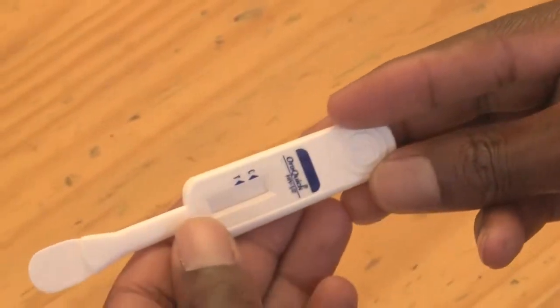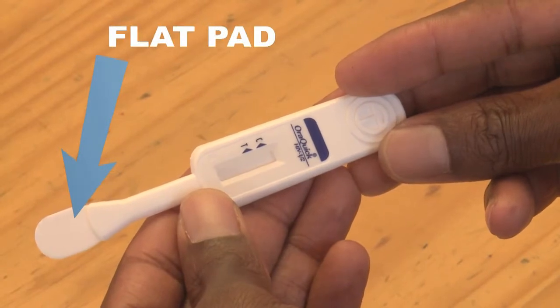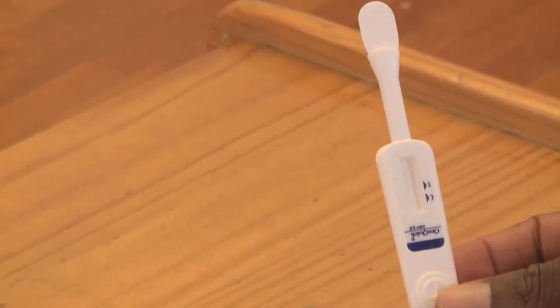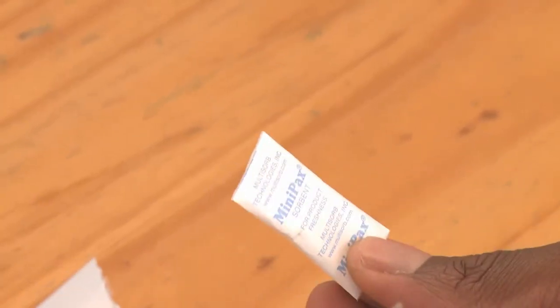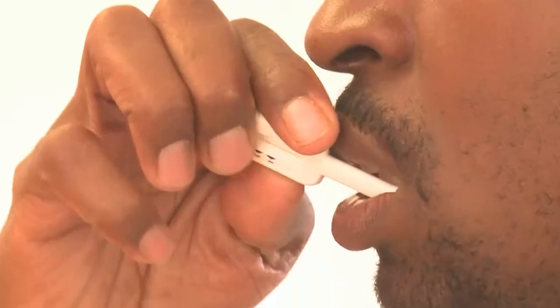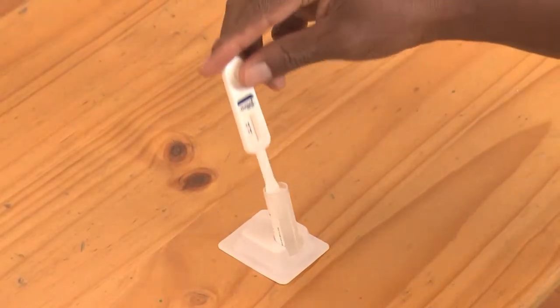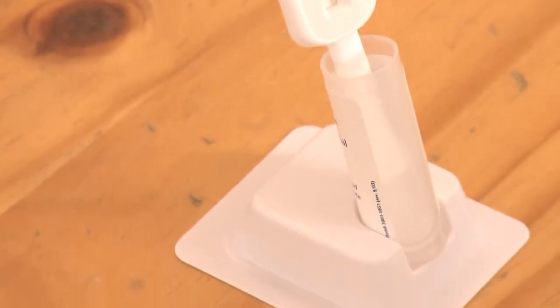Open the other pouch and take out the test device. Do not touch the flat pad when removing the test device — use the handle instead. The same pouch will contain a desiccant packet; throw this away as it is not needed for the test. Holding the handle, use the flat pad to swab your upper and lower gum one time around each gum. Immediately place the flat pad into the opened bottle until it touches the bottom of the bottle, and note the time.